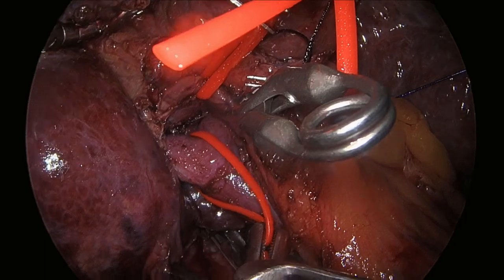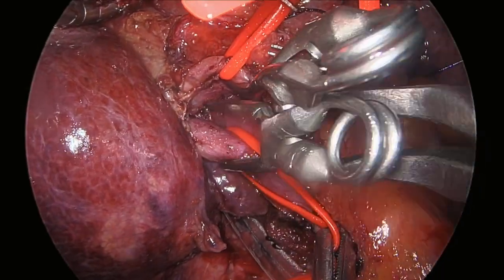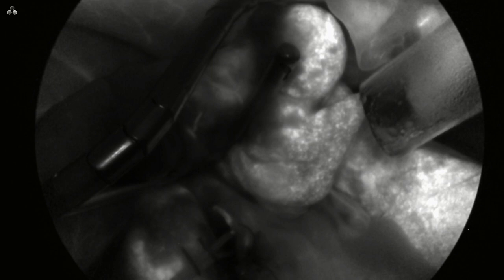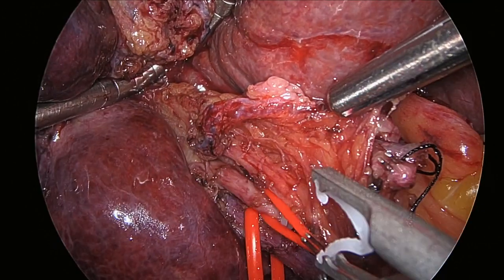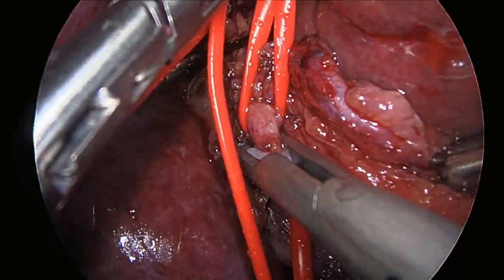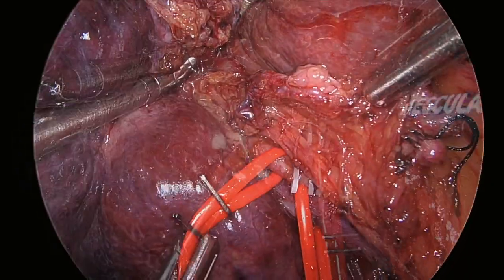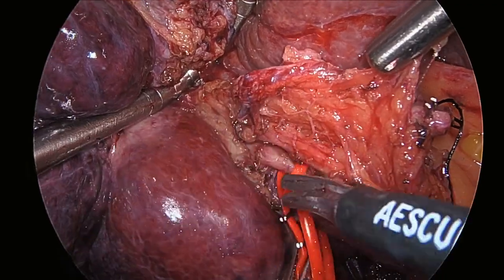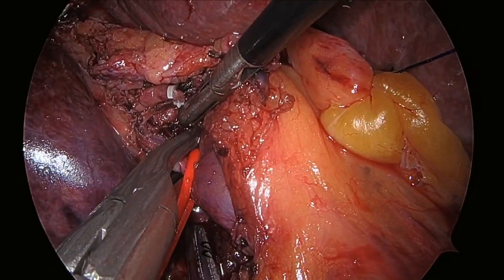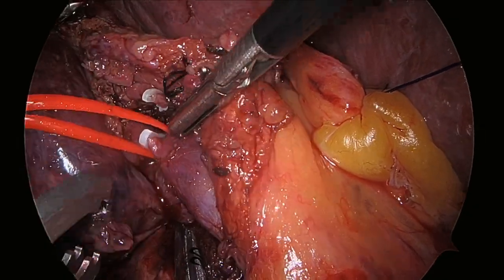Inflow vessels to the right lobe are then clamped and 2.5 milligrams of ICG are administered in a negative staining method. Here we see great uptake in the left lobe as well as the caudate lobe with no uptake in the right lobe. Good Doppler signals were also confirmed in the future liver remnant with ultrasound. The right hepatic artery is first ligated and divided between medium hemoloc clips.